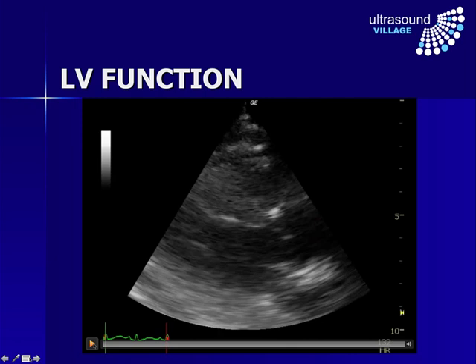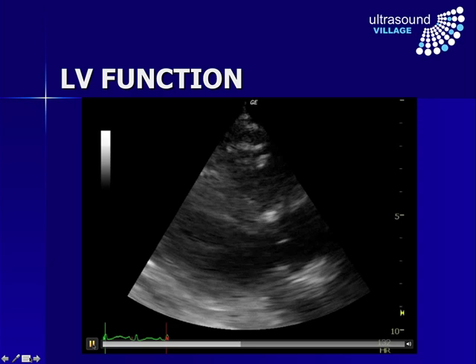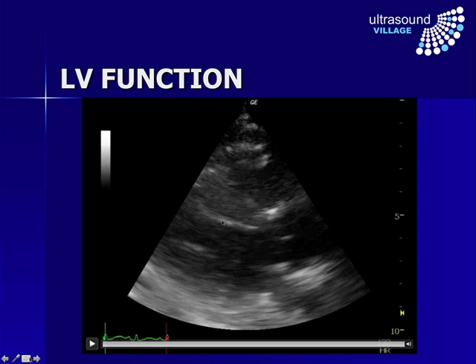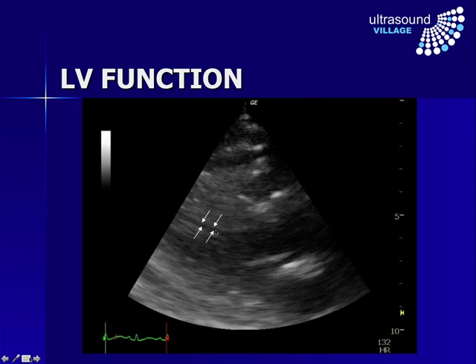This is from a different patient — a patient who was septic. We can see here the septum and the posterior wall, and as it loops through, they virtually touch. This is what we refer to as the kissing ventricle, and this is a sign of a relatively underfilled ventricle that is hyperdynamic.